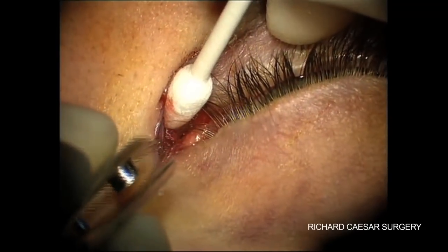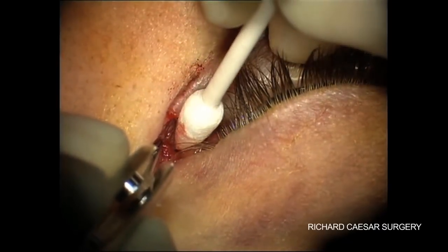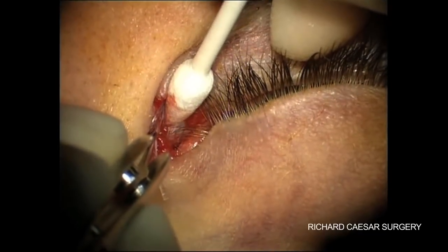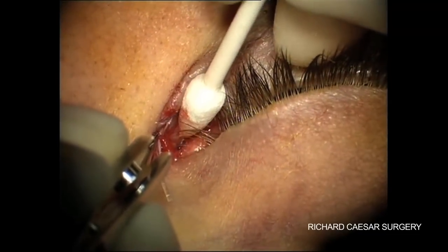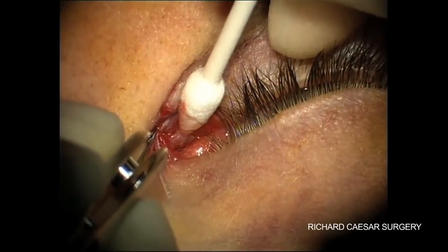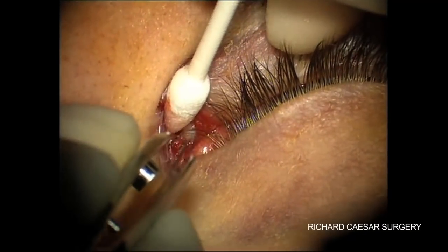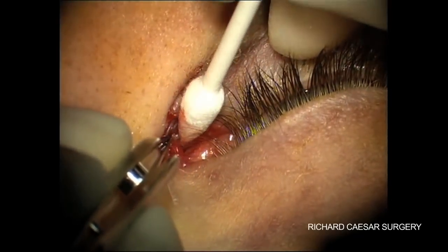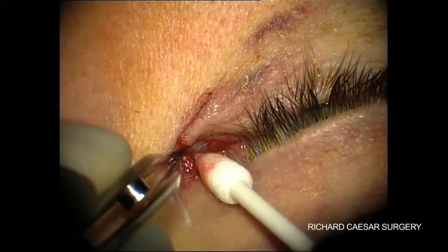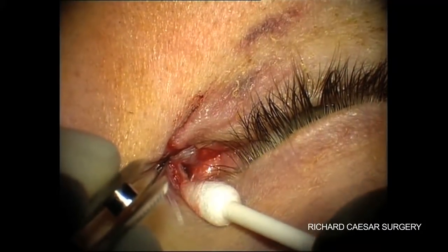Now here with the microscope, I'm just teasing my way down, and you can start seeing just in that corner near the tip of the cotton bud, the canaliculus. With the phenylephrine, the lips of the canaliculus can often be made to pout a little, which makes it a tad easier to find. To check that you've got the canaliculus, if you grasp the tissues, just making sure you're holding the canaliculus open, if you take a probe and slide the probe in, it should pass freely and easily through to the sac.